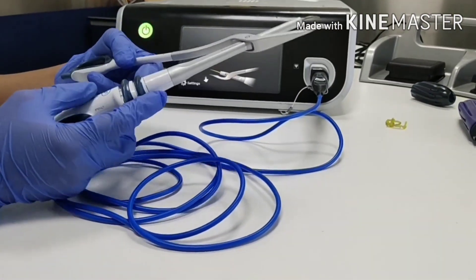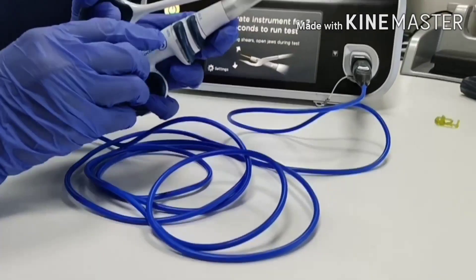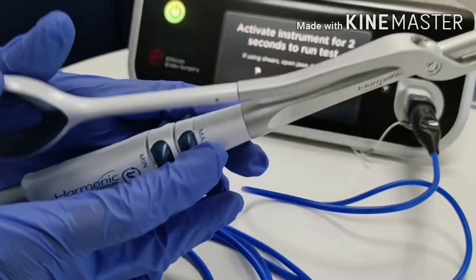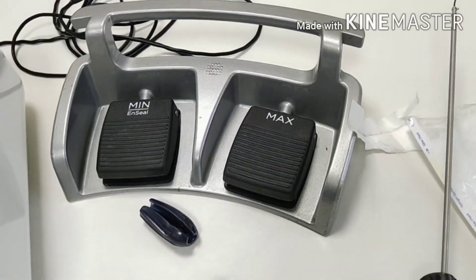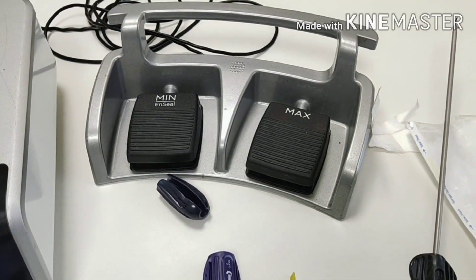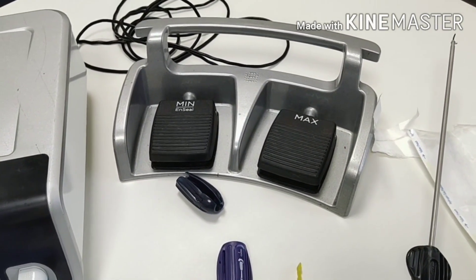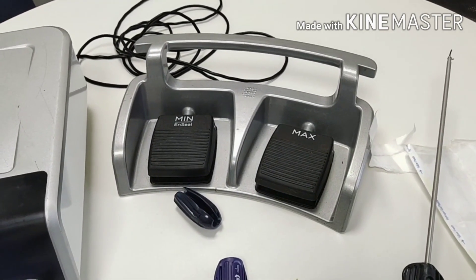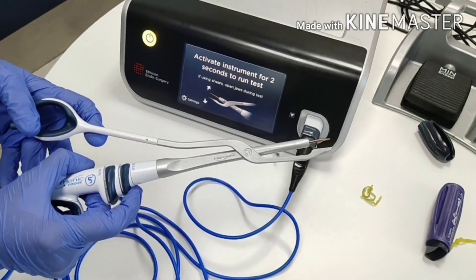Either press one footswitch key or handpiece key. These are the two handpiece keys. This is the maximum key and this is the minimum key. Minimum is used for coagulation; maximum is used for faster cutting. Minimum can also be used for cutting, but it will first coagulate and then cut. Keep jaw open and press one key for three to four seconds.